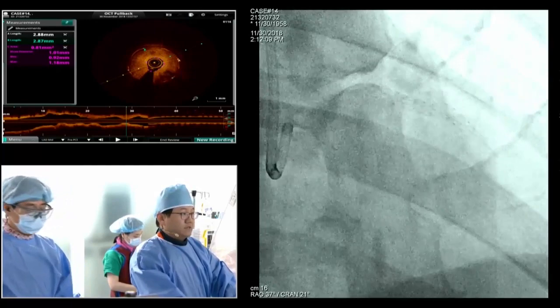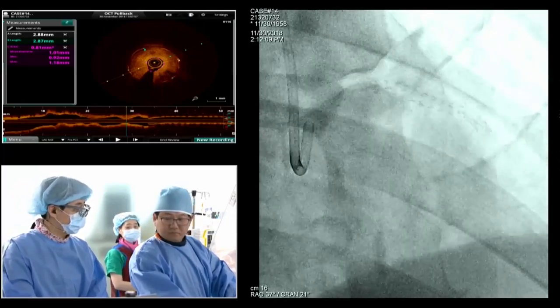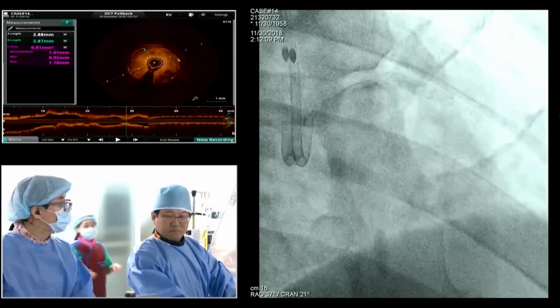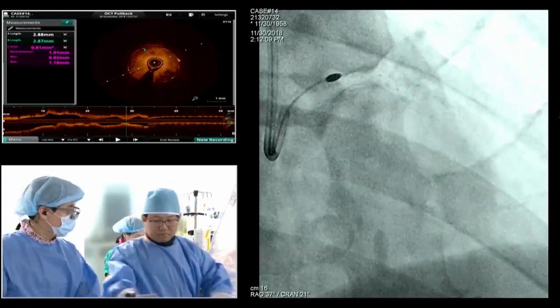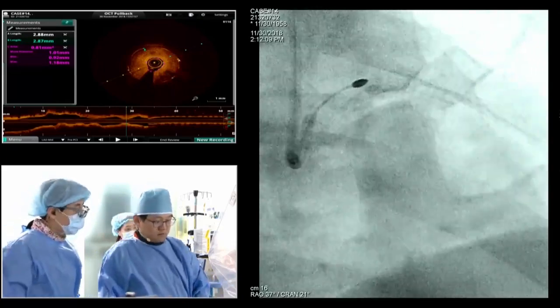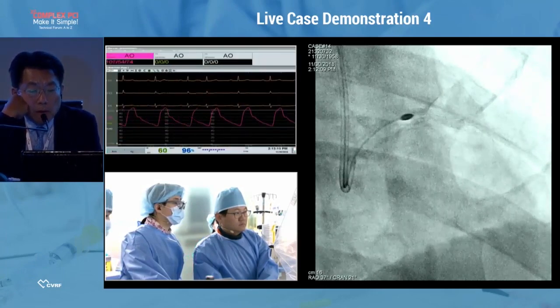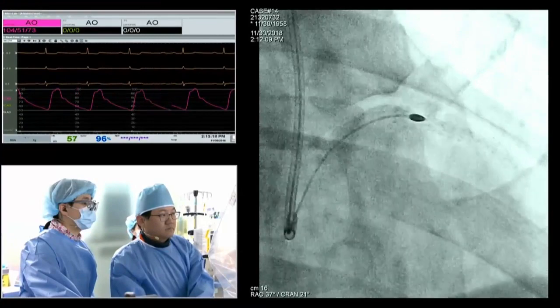This is a 7 French guiding catheter. Does the rota stent protocol require information regarding ischemia? As far as I heard, we don't know whether this in-stent restenosis is causing ischemia or not. A big burr, 2.0. Without rotablation with a small burr, there may be more plaque embolization. Very slow. And I think guide support would be an issue as well, because the big burr and the stent may be in your way a little bit here and there.